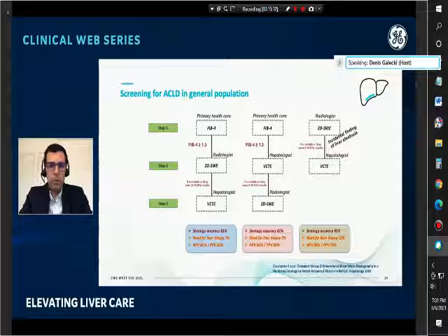In particular, strategies using a simple and low-cost biological fibrosis test, such as FIB4, at first step, and a complementary use of shear-wave elastography and FibroScan at next steps seem to be very promising. And very interestingly, in such strategies, shear-wave elastography and FibroScan are not seen as concurrent, but as complementary tools.